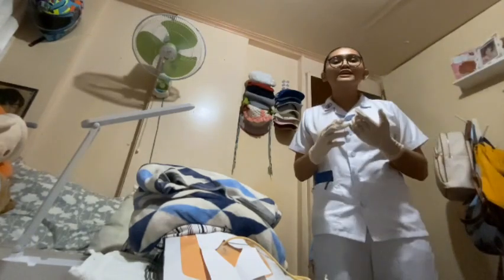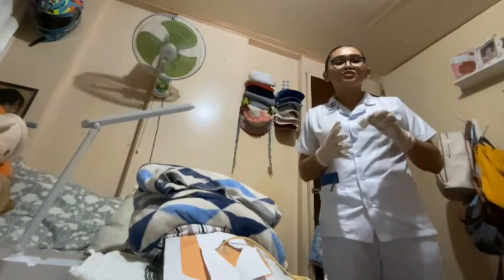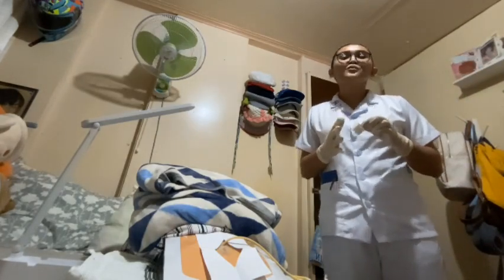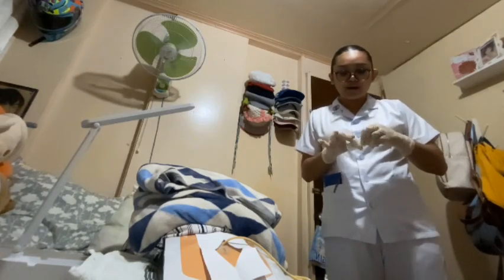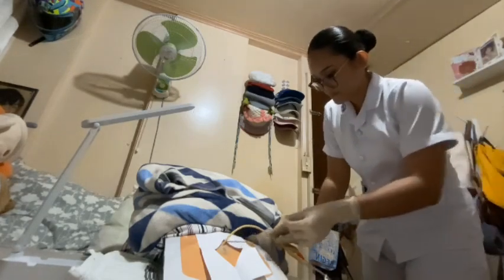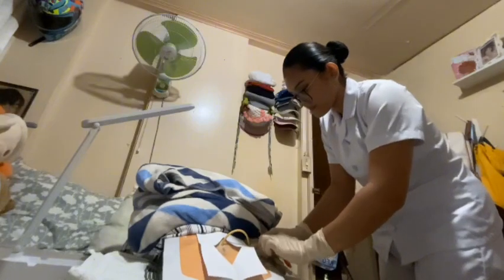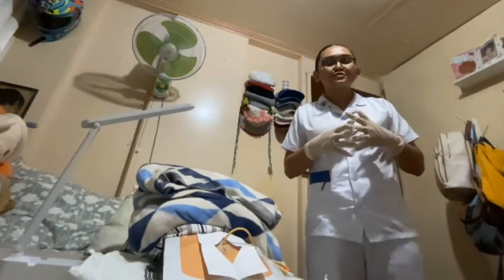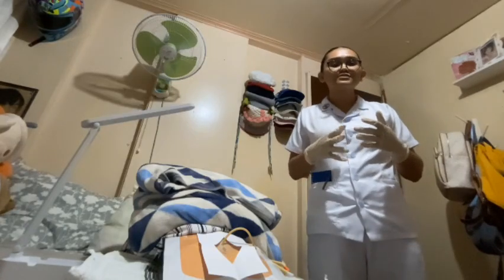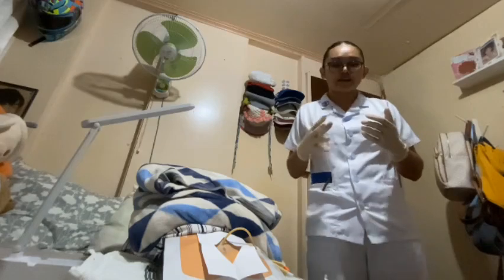Now I will secure the indwelling catheter by taping it to the patient's thigh, allowing some slack of the tubing to accommodate the patient's movement to prevent accidental pulling and reduce trauma during movement. Okay, ma'am, I will tape this to your thigh po. Now I will discard all used supplies in appropriate receptacles and remove gloves, then discard, since proper disposal prevents cross-contamination and infection spread.